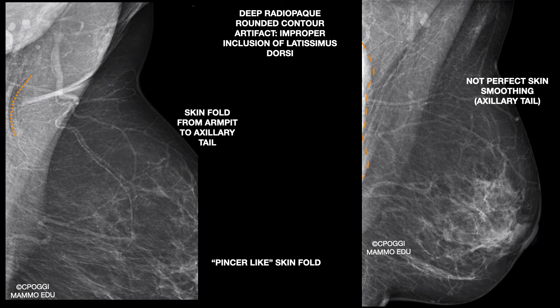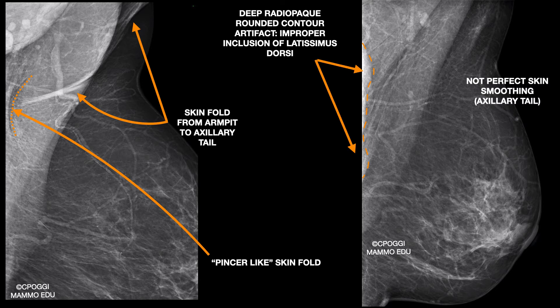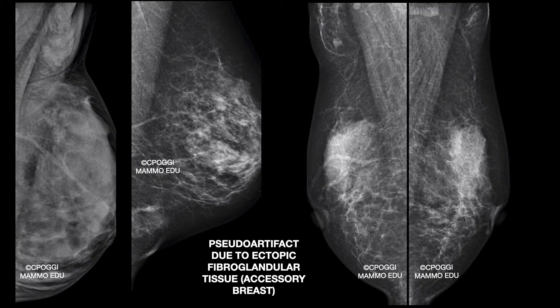Here is a fold that extends from the pectoralis major to the axillary tail, and also an inner pincer-like fold, commonly seen in this portion of the breast due to not effective tissue stretching. Here you can see an artifact due to the wrong inclusion of the medial central part of latissimus dorsi. This one in the axillary tail is very common and is not a real fold, but it could be mistaken for ectopic breast tissue.